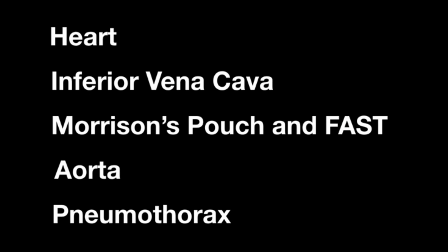Next, we move on to our I in the HIMAP. This refers to the IVC, as you may have guessed. Now, there has been some debate regarding the evaluation of the IVC and volume status, with more improved ways of truly assessing volume status.